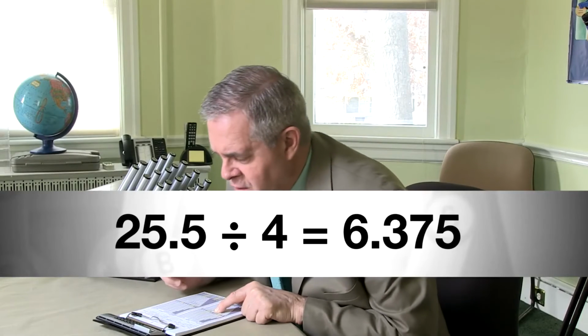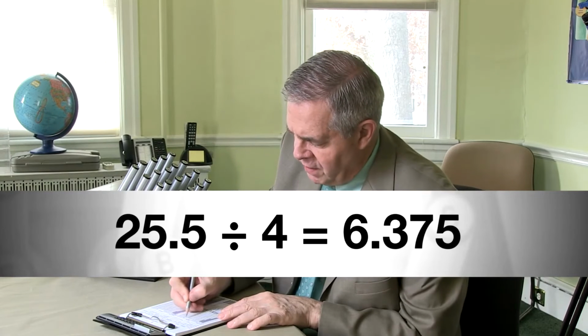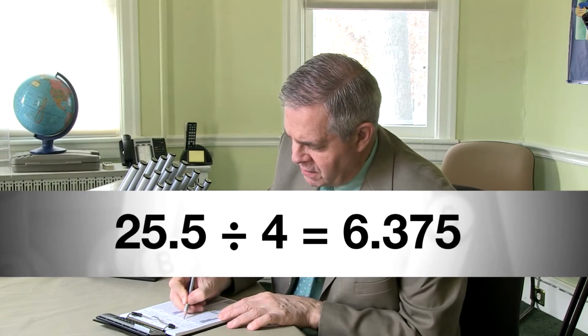And we come up with a measure of 6.375. So his threshold in logs is 6.375. It's actually a negative number. You can leave that out. It's a little confusing, but that's how we calculate the threshold for this individual with these reversals.